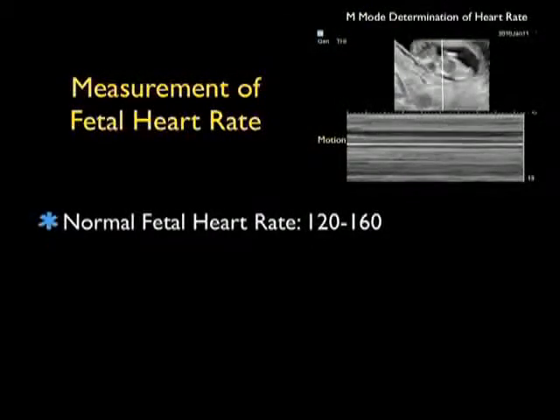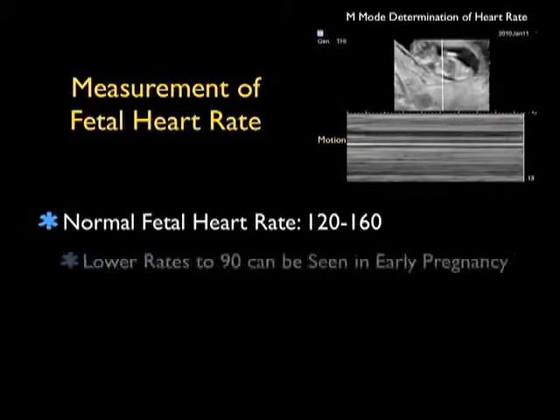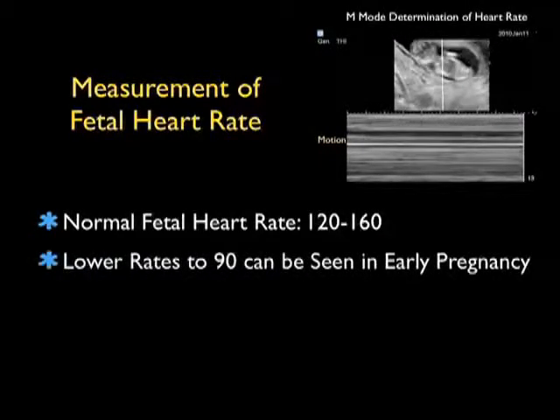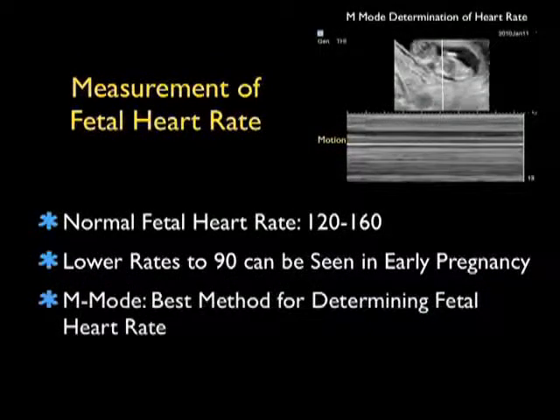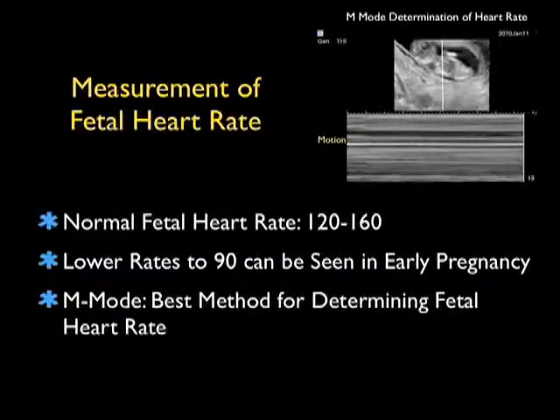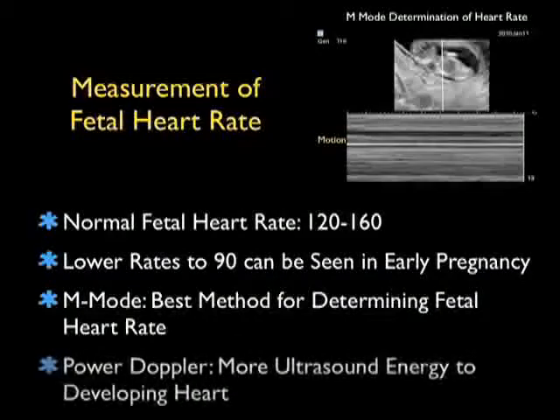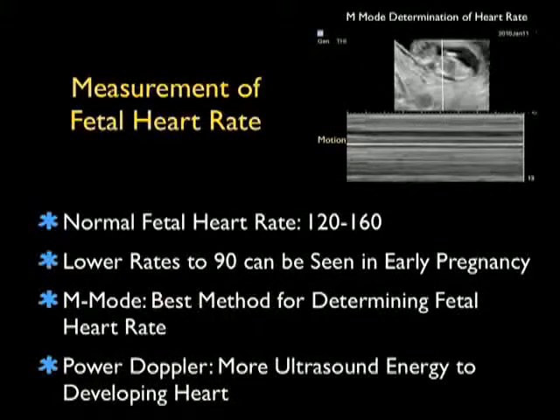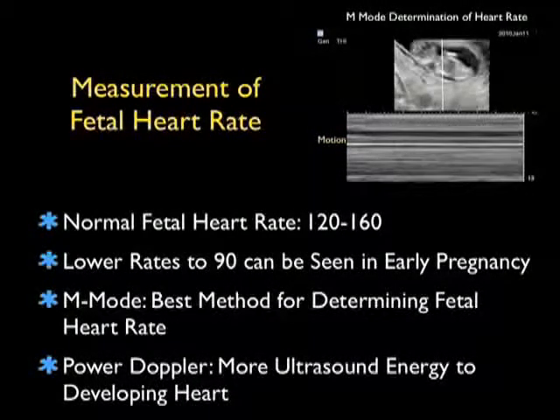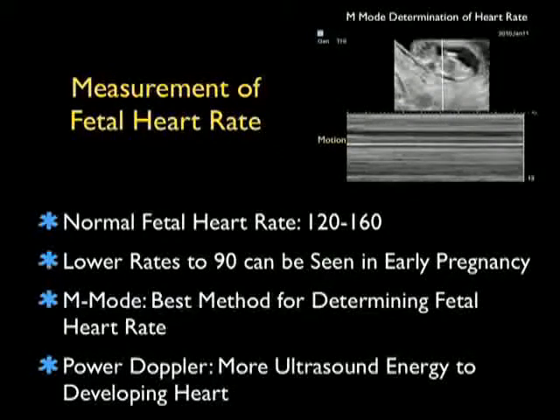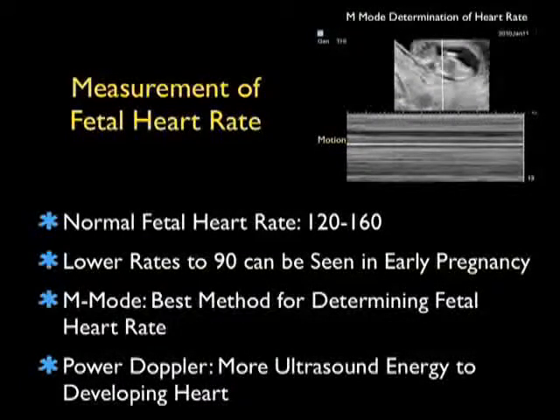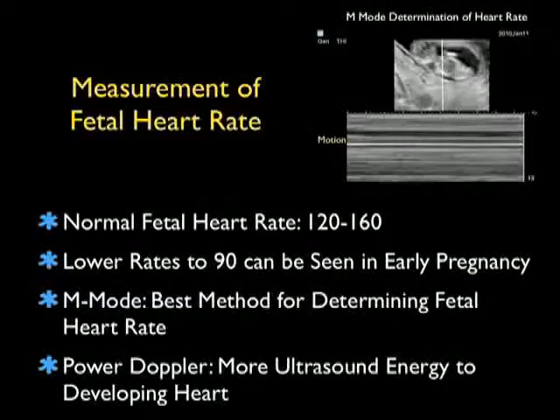In addition to measuring the gestational age, another very important concept is to get a measurement of the fetal heart rate. Normal fetal heart rates will range from 120 to 160 beats per minute, but lower rates down to 90 beats per minute can be seen in early pregnancy in the early parts of the first trimester. M-mode is the best method for determining fetal heart rate. Power Doppler, in contrast, gives more ultrasonic energy to the developing heart. Thus, M-mode is the preferred way of measuring the fetal heart rate.